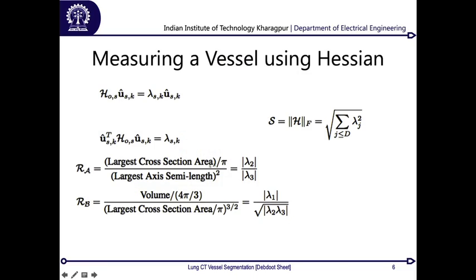So that comes down as just the ratio between the amplitudes of these two vectors, the second eigenvector and the third eigenvector, the value of the eigenvector, sorry. So it becomes the ratio between the second eigenvalue and the third.